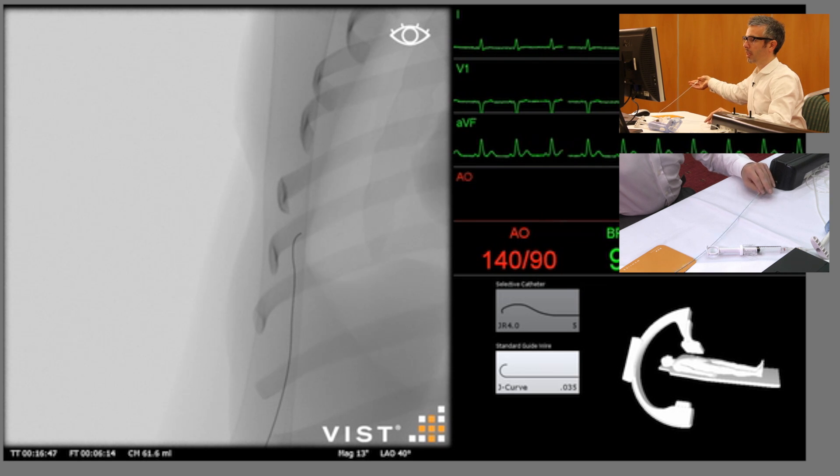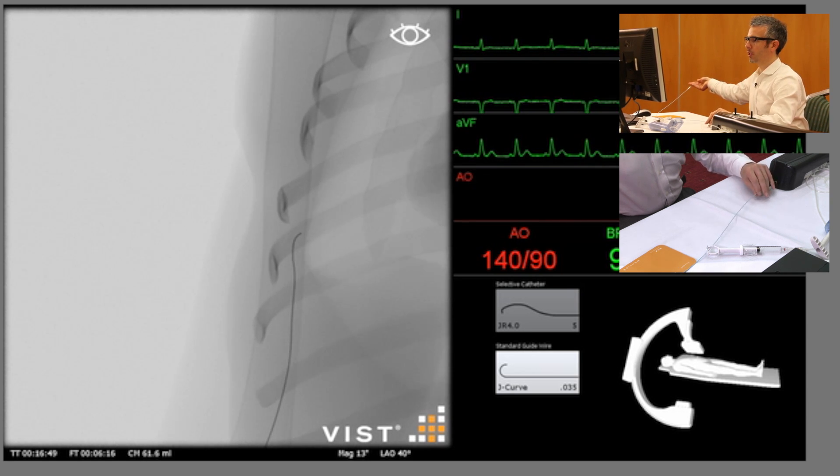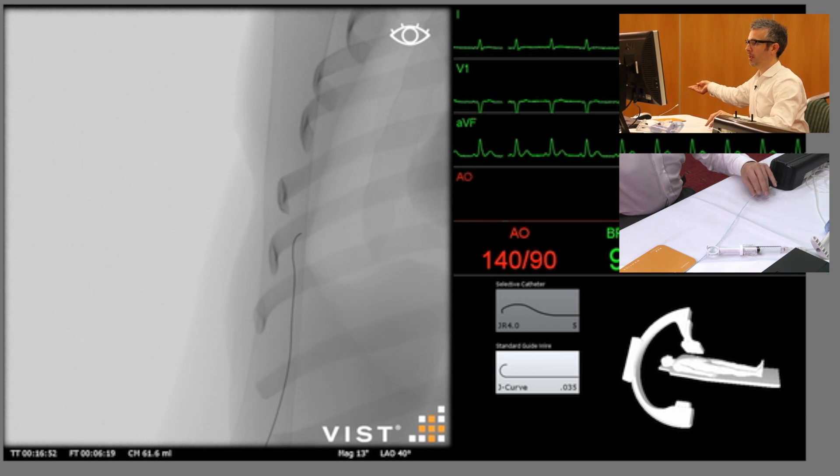I'm then going to advance my guide catheter. In this case I've got a Judkins-Rite 4 guide catheter up at the arm.